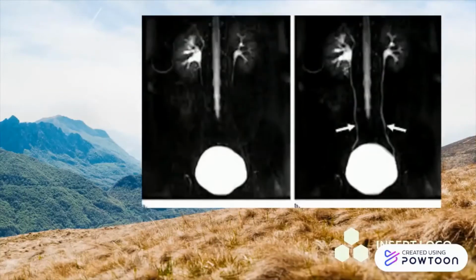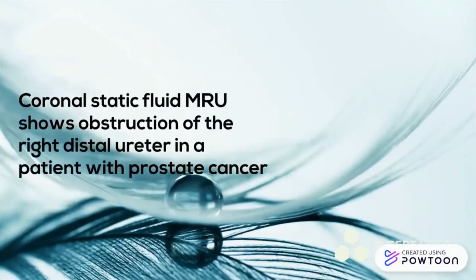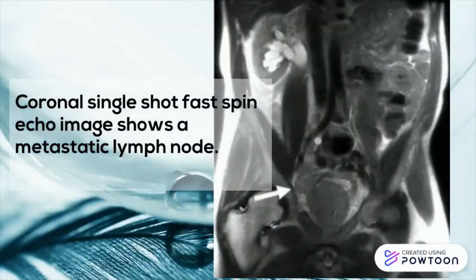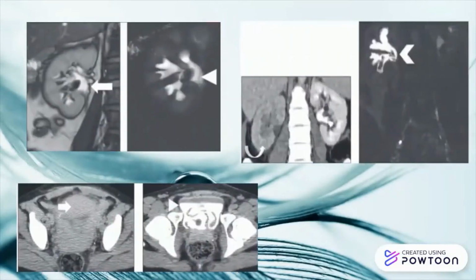Static fluid MRU demonstrates the collecting system, ureters, and bladder. Coronal static fluid MRU shows obstruction of the right distal ureter in a patient with prostate cancer. Coronal single shot fast spin echo image shows a metastatic lymph node. So, I guess this brief description has given a picture of how an MRU works.